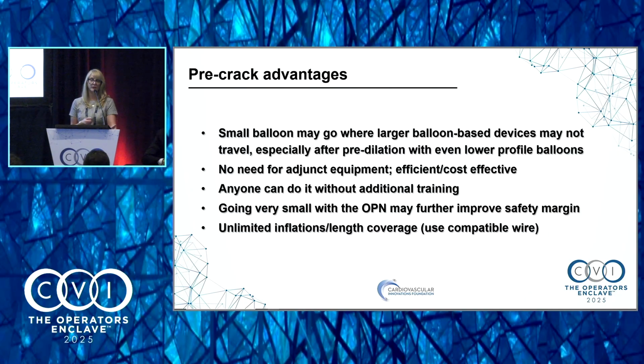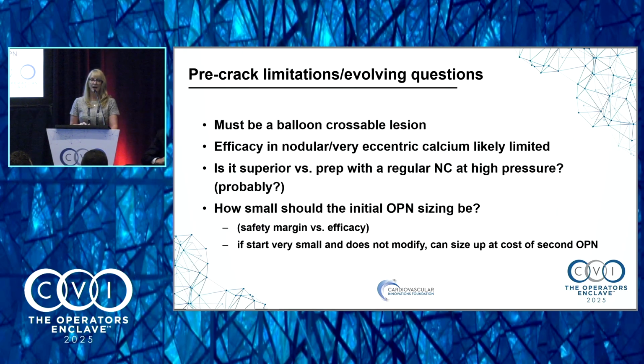It's obviously a balloon-based technology, so it's simple and potentially a bit more cost-effective. Anyone can do it without additional training, provided that you understand how to use the device effectively. And going with that very small OPN initially may further improve your safety margin with the device. Of course, there's an unlimited number of inflations that you can do, and you can inflate over a long lesion, so that's handy as long as you use a compatible wire that's not going to stick to it.